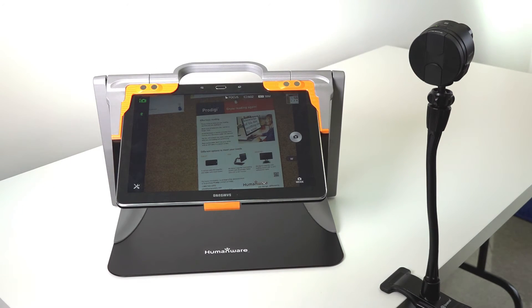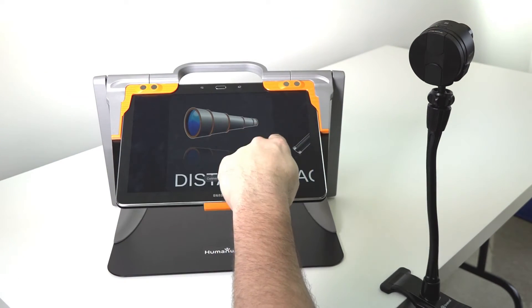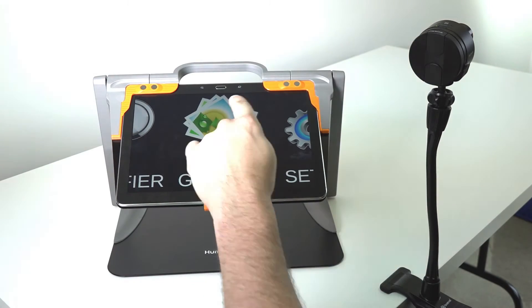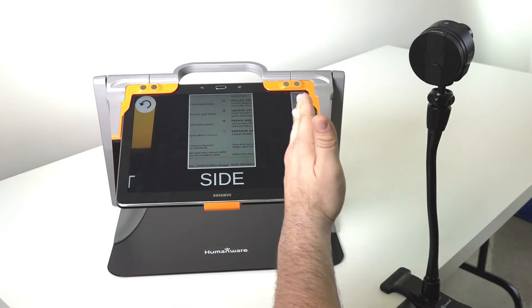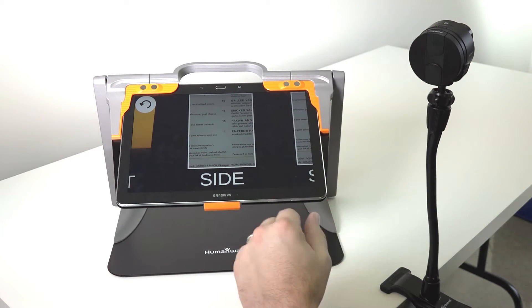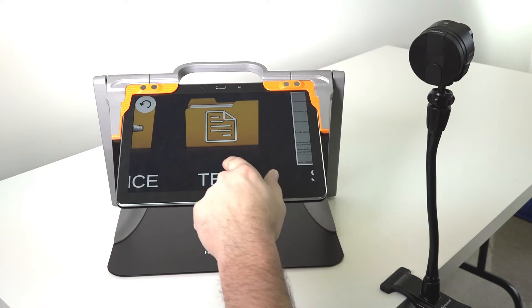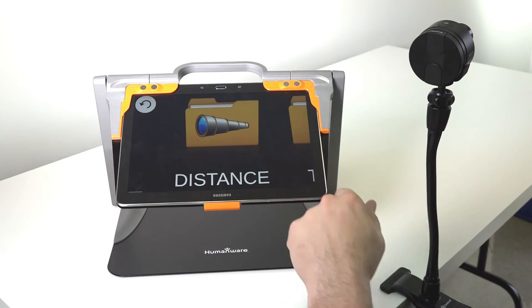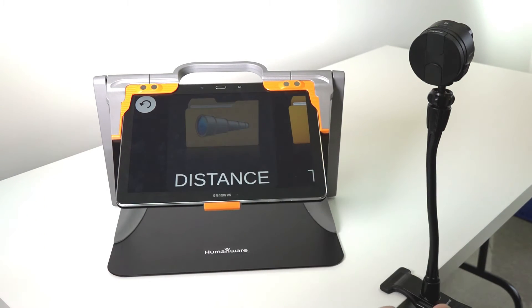To do so, press the home button to exit back to your carousel, then swipe to the gallery and tap once. All the captures on the right side are documents you've captured. The text section contains documents you may have captured in your clipboard, and the last icon is the distance viewing images.